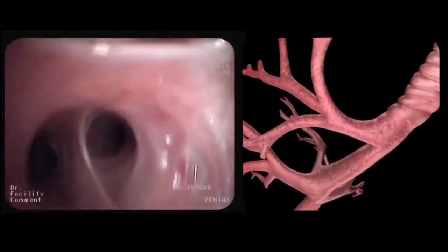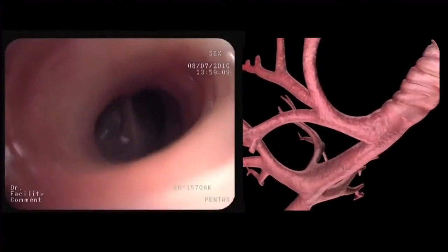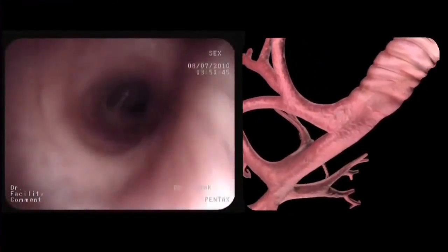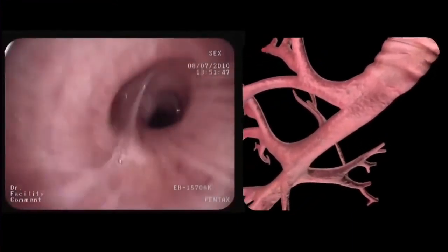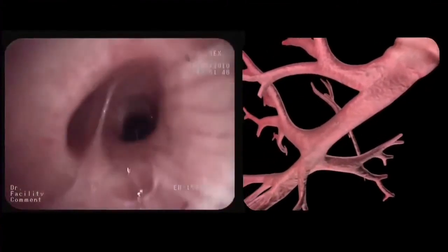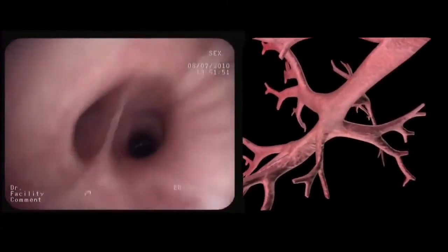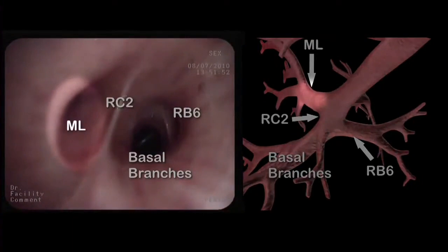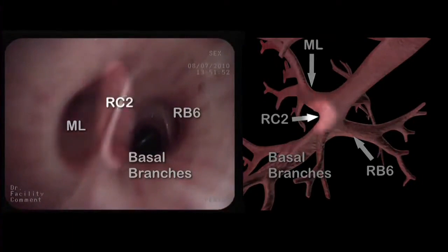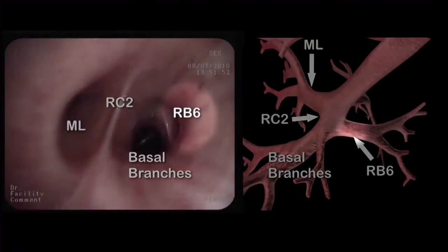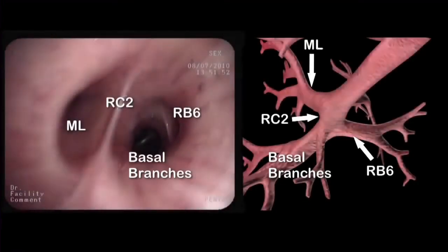We then head back and extend the bronchoscope into the intermediate bronchus. Here we identify the orifice of the middle lobe, the right carina 2, the basal branches, and the apical segment of the lower lobe or RB6.